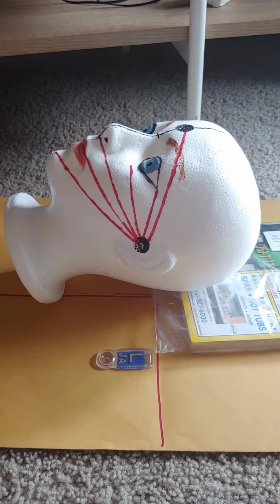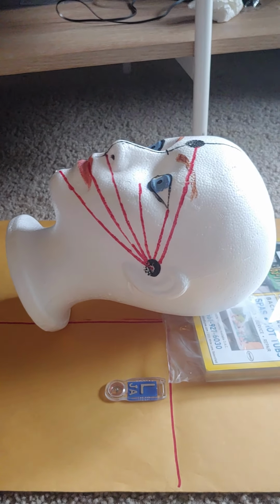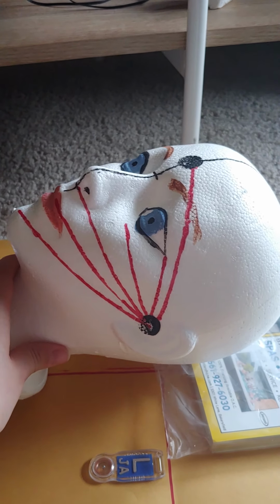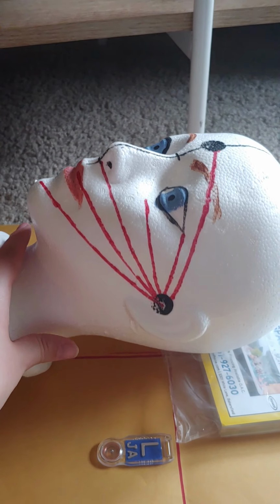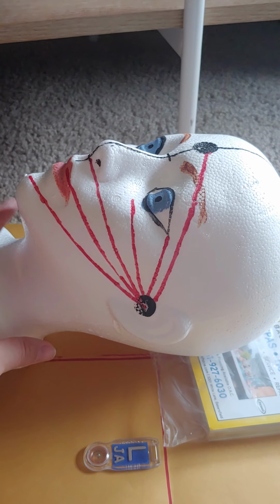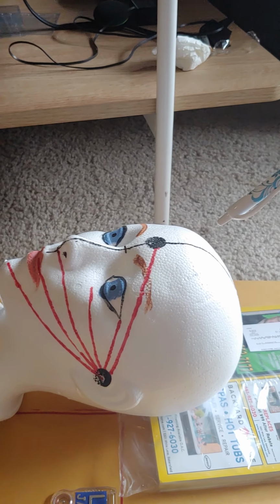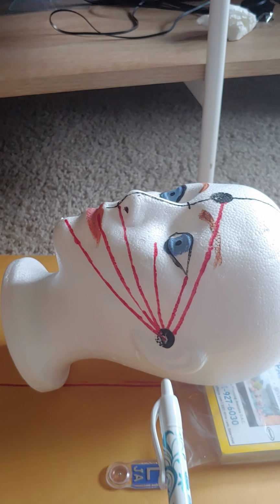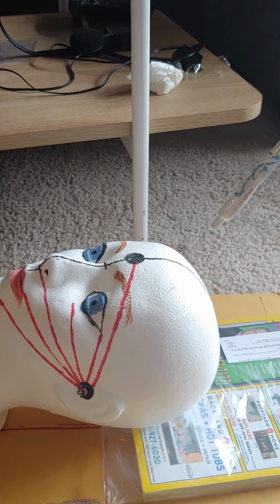This is my AP axial Towne method. For this projection, for the positioning lines, you want the OML to be perpendicular, so my head would be more like this, but I can't really get it to stay up. So if the OML were to be perpendicular, you would use a 30-degree caudal angle. Since my head is more sitting with the IOML perpendicular, then you would change the angle from 30 to 37 degrees.